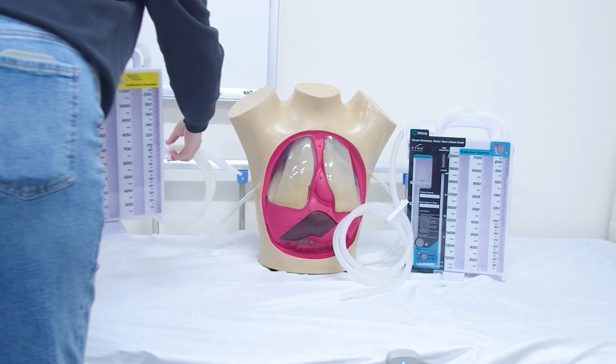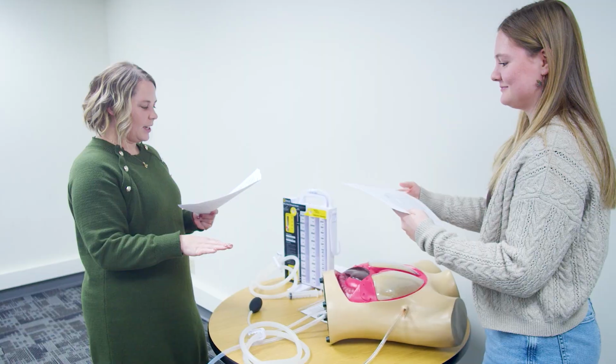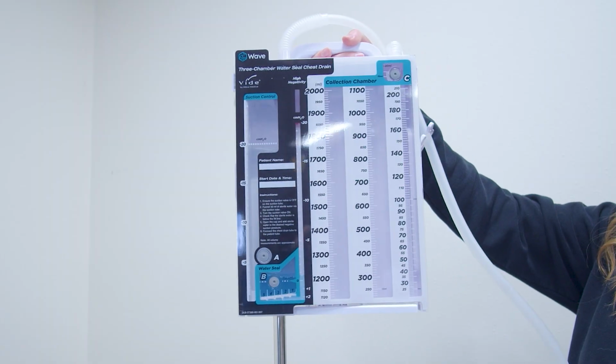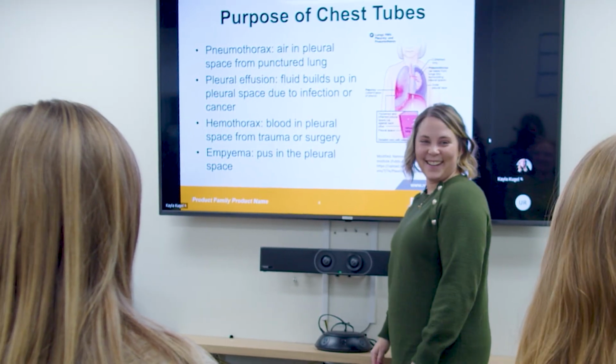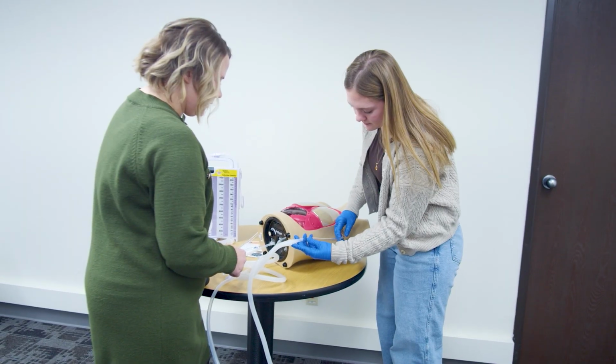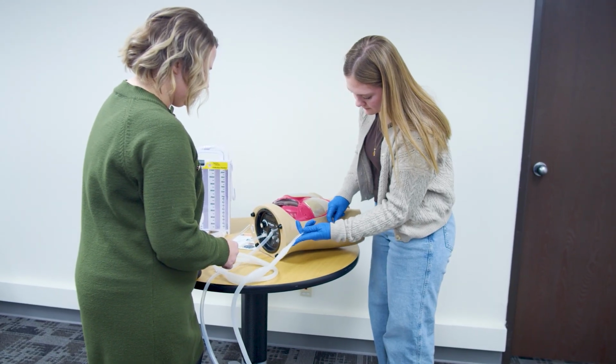Using this simulator and curriculum, you'll give students hands-on practice, teamwork, and confidence to excel in healthcare. We are excited for you to join a growing community of health science educators raising the bar for safety and skill across career pathways.